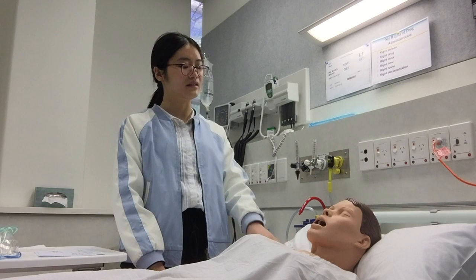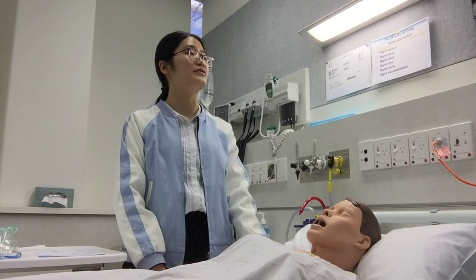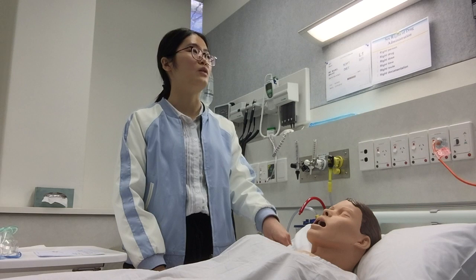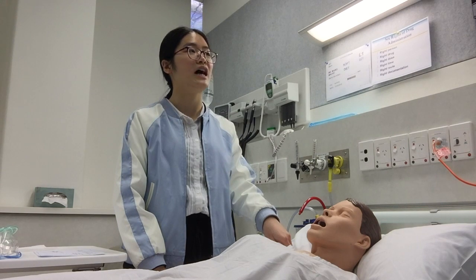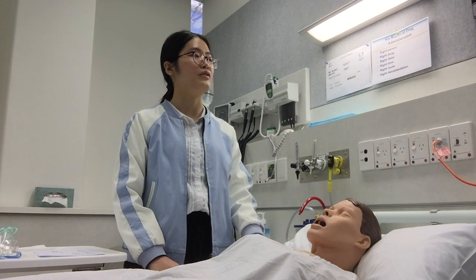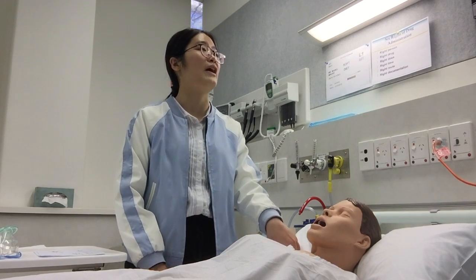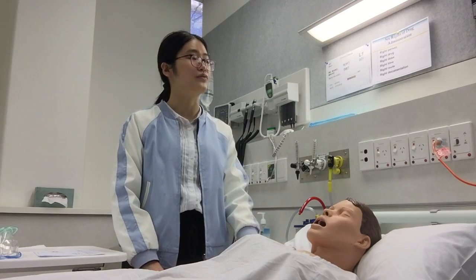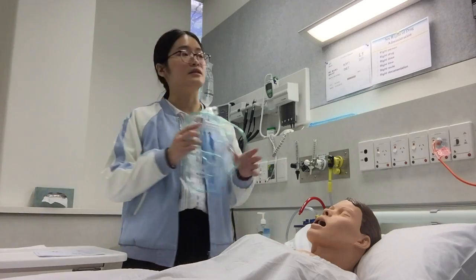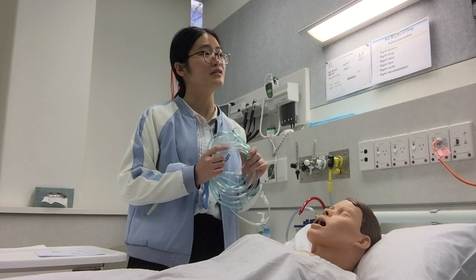Another thing I want to ask you is, after we finish the oxygen delivery, do you know what else we need to do? Like waste disposal and hand hygiene. So always remember to follow the rules of hand hygiene before you touch the patient and after you finish the procedure. You also need to remember, if this device is for this patient, can it be reused for another patient?